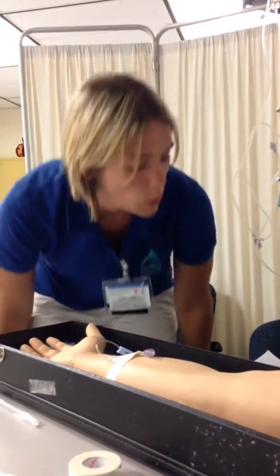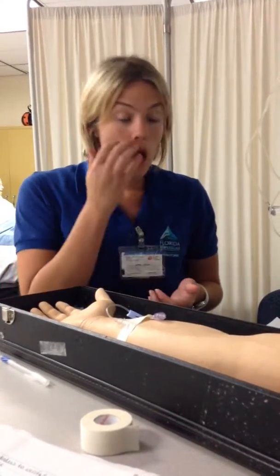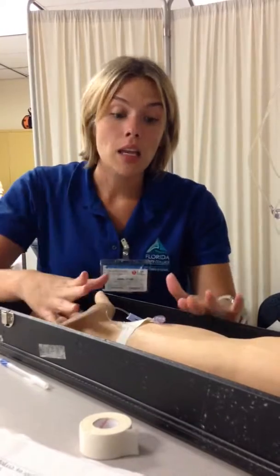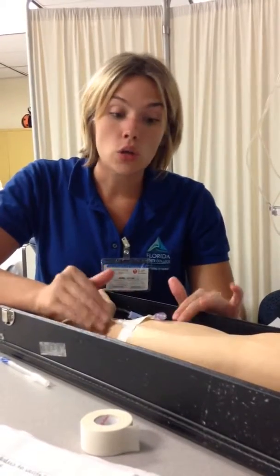Now I'm going to document it. I'm going to unscrew this, dispose of this, then document the medication administration on my MAR. I'm going to record the start and finish time. The condition of the site at this point: it's patent, it went in nice, there's no swelling, no tenderness, and the patient has no complaints. I'm going to record the saline flush volume.